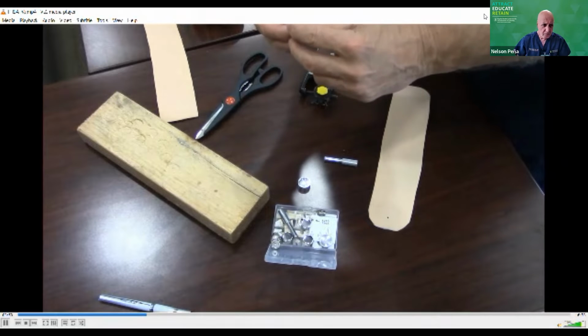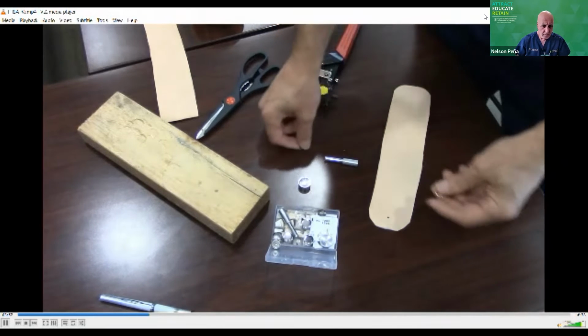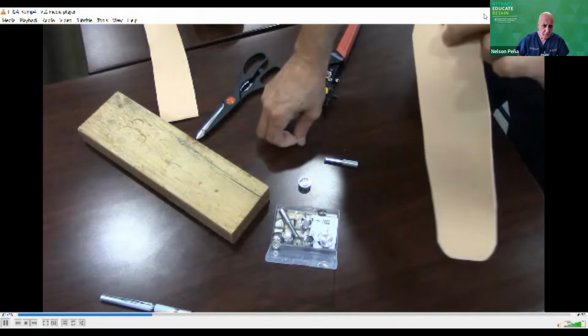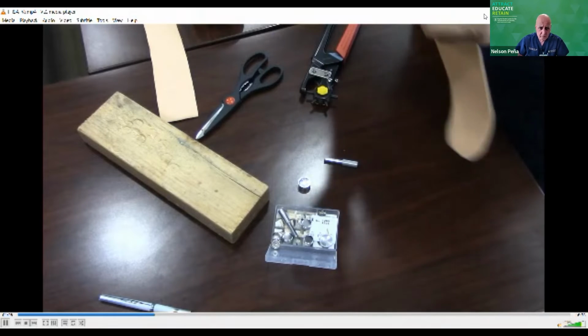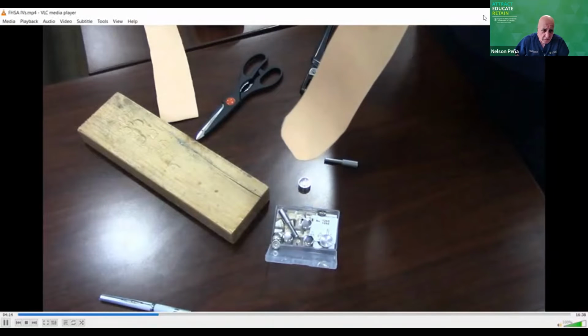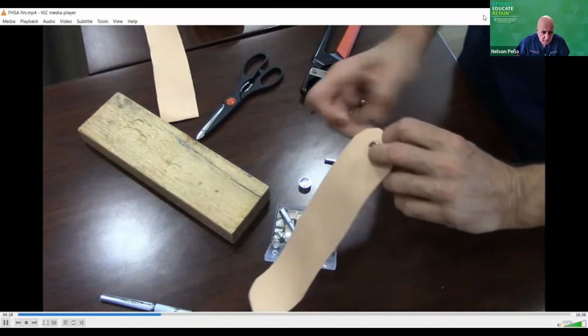So now I'm going to take the snap I'm going to use, and put it through the hole here. And then I'm going to put the other part that's going to snap on the bottom, through the bottom. Okay, let me show you that again. Put the snap through the top, and this part through the bottom. There, got to make sure I stay in the camera zone.